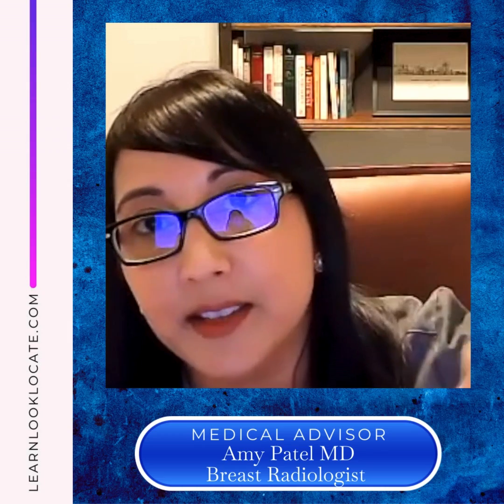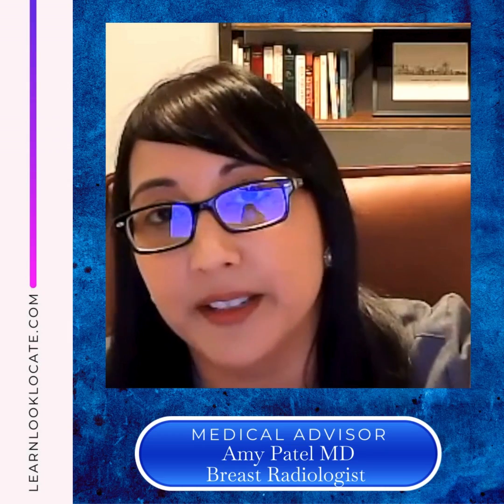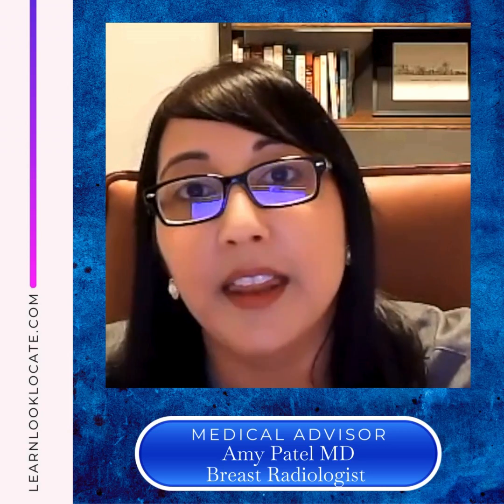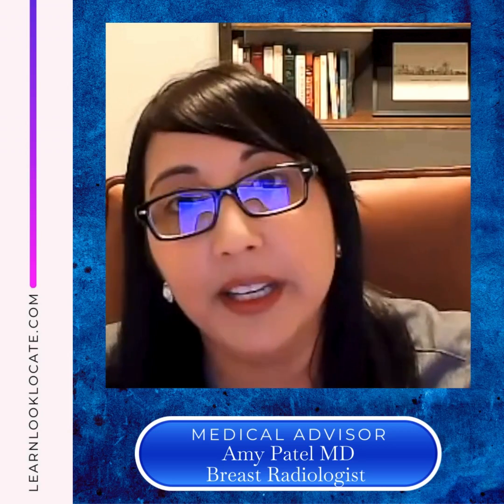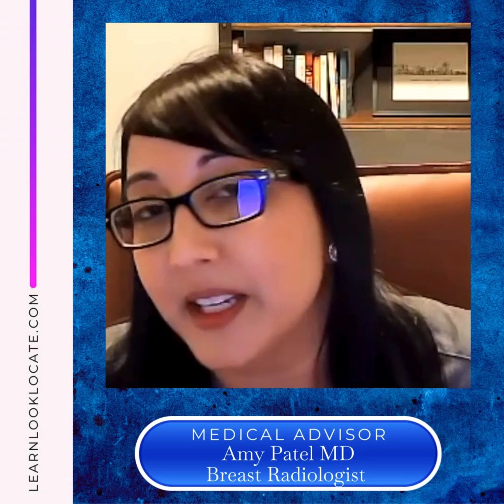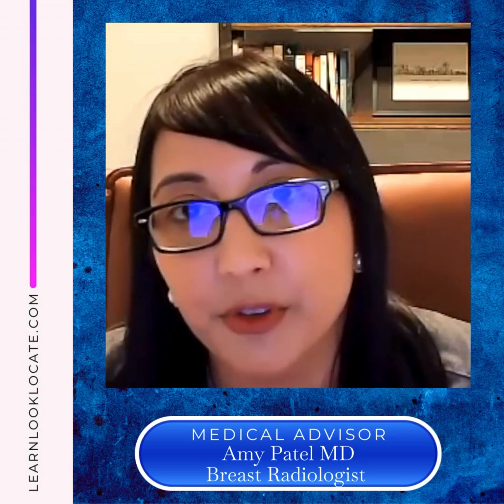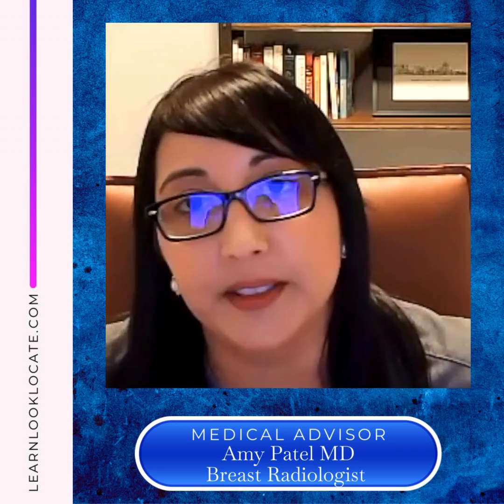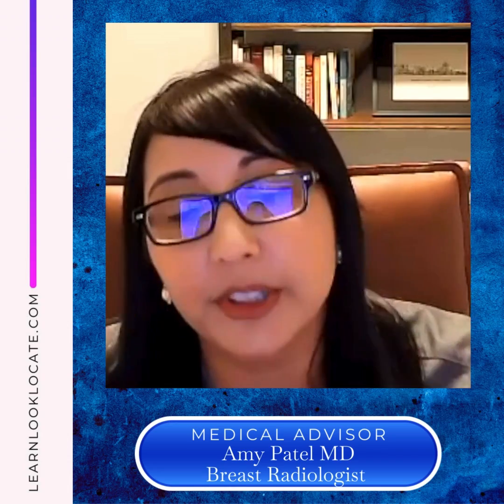If we see something that's asymmetric in one breast and we don't see it in the same position in the other breast, that warrants, hey, maybe we need to look at this further. Maybe this is just more than normal overlapping tissue. Maybe this is something subtle, like a very subtle cancer or something of that nature. So for us, symmetry and pattern recognition are really important in breast imaging, especially when you're looking at a mammogram.